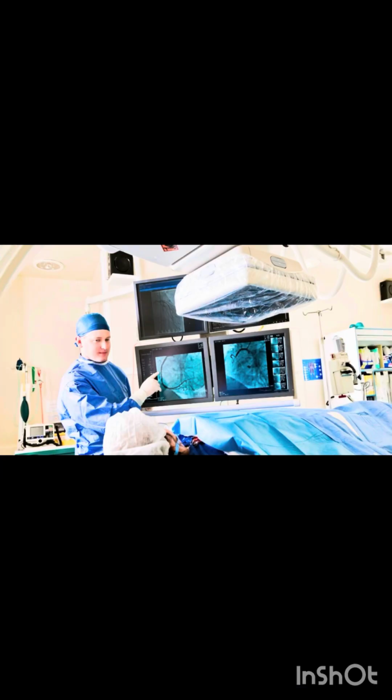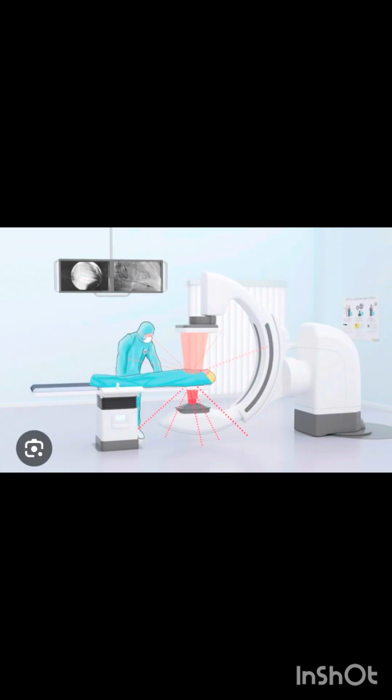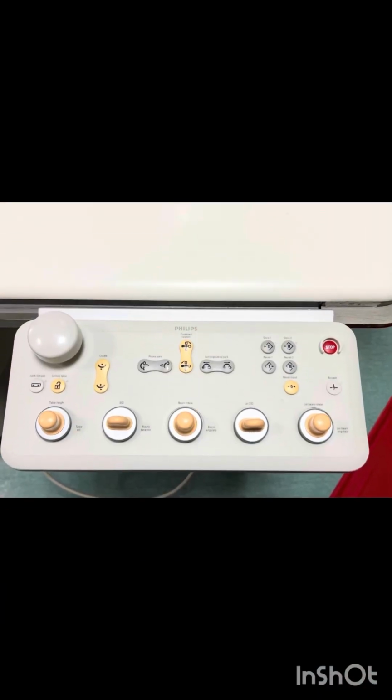This study used RaySafe I2 dosimeter badges on 9 participants during 46 invasive cardiac procedures in 2021 over a 4-month period. The findings of this study showed that scrub techs were given more protection due to lead shields and stationary roles, whereas on the flip side, rotating staff working closely with patients during combined procedures received over 3 times the radiation exposure than the techs had.